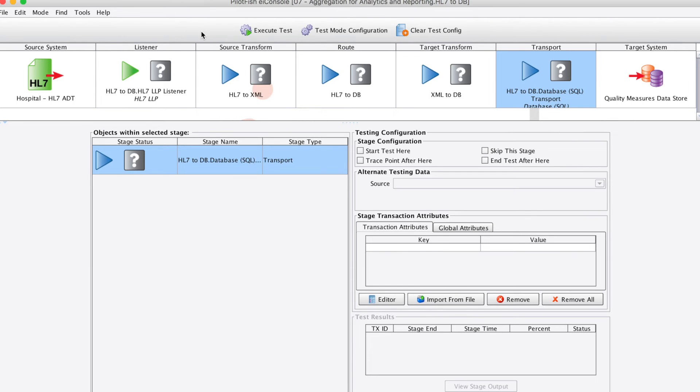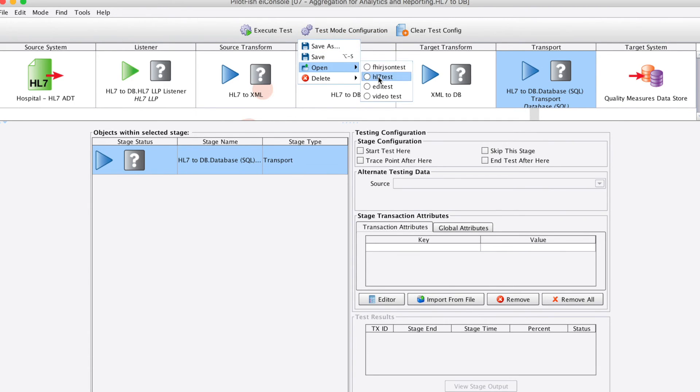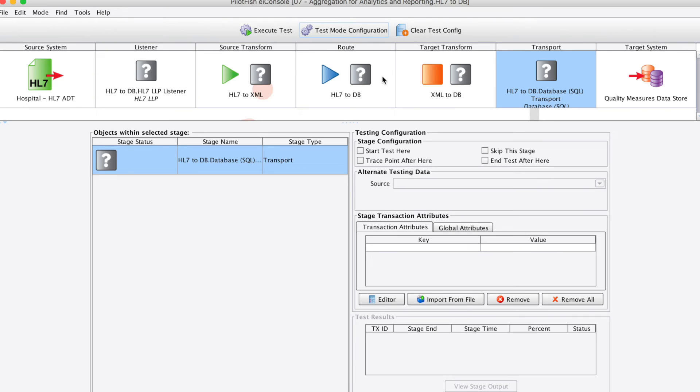In this case, we'll use a pre-saved configured test that we are using because we're not actively listening on a TCP port for an HL7 stream. This pre-saved test will start after the listener stage and we'll feed it a sample file. Once we hit execute test, you will see the question marks turn to green check marks.